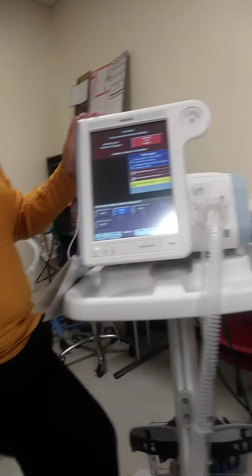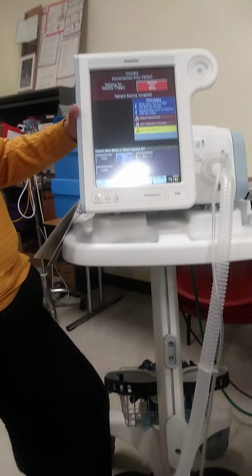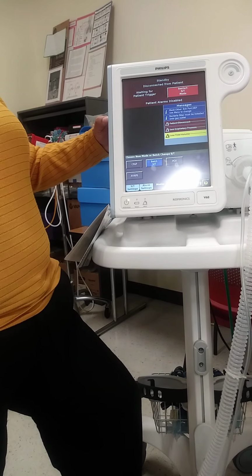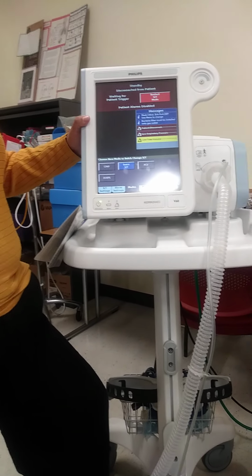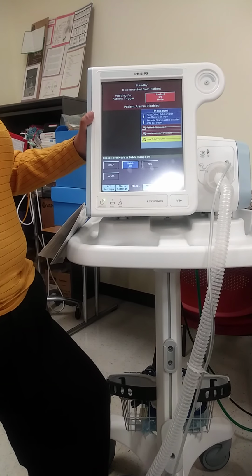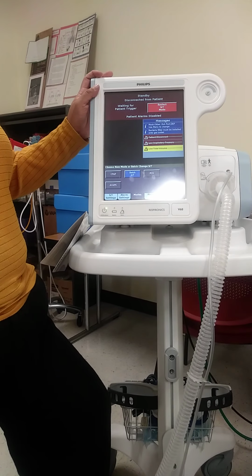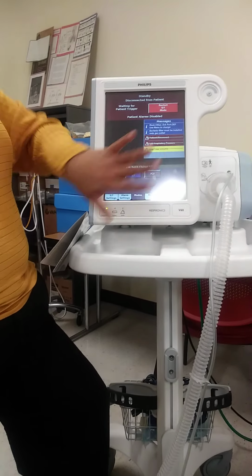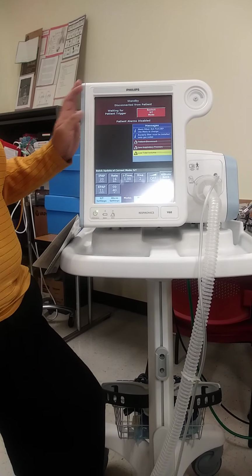So we have CPAP, which is what we would use for what instances? When would I use CPAP? For home use, right? You could also use it at the hospital. You'll use it a lot at children's, where babies are on CPAP, but we use it for sleep apnea, and it's also really good for oxygenation purposes. AVAPS and pressure control ventilation are a whole other mode. I won't talk about those, but ST means BiPAP.